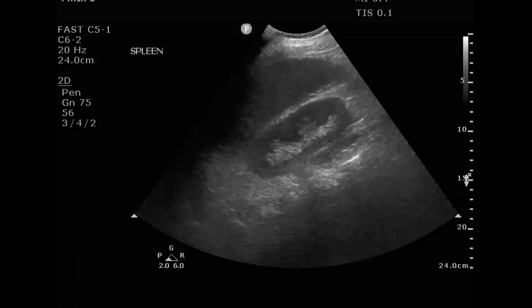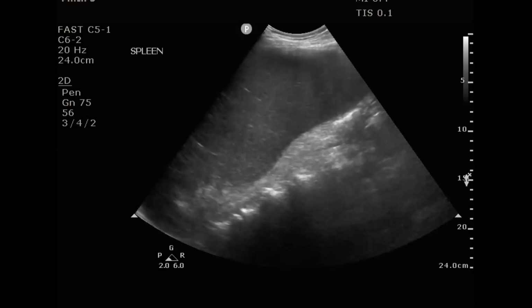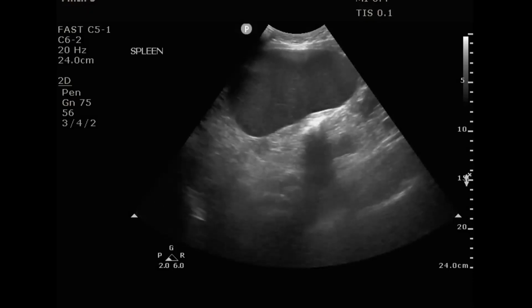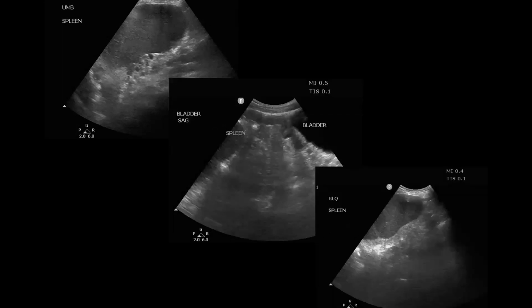So here's another example of splenomegaly, and you can see that this kidney is actually squished. And you can see that this spleen goes on and on. Now we're going down into the left lower quadrant, and on and on. And in fact, in the umbilical area, you can still see the spleen. You can see it just above the bladder, and you can actually see it in the right lower quadrant. This was a gentleman who complained that he was having pain and he felt like he was growing a banana inside his abdomen, and he actually looked like he had a banana inside his abdomen. This was the biggest spleen I have ever seen.